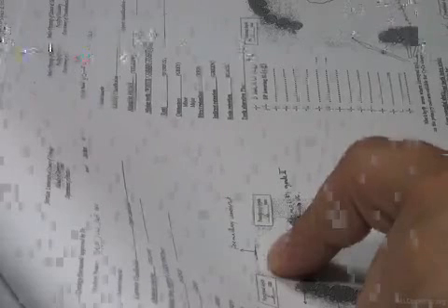But I have a condition when I want to do this. All of my guide planes, I prepare them in the new orientation, not the old one. I don't do vertical guide planes on the teeth. I tilt all of the guide planes in the path of insertion direction. Okay? Another option, no undercuts, for example. Why not use a premaxillary undercut? And this is also tilting and tilting the guide plane preparations in a new path of insertion. I tilt the cast posteriorly on the survey machine or the survey table. So it's a posterior tilt.